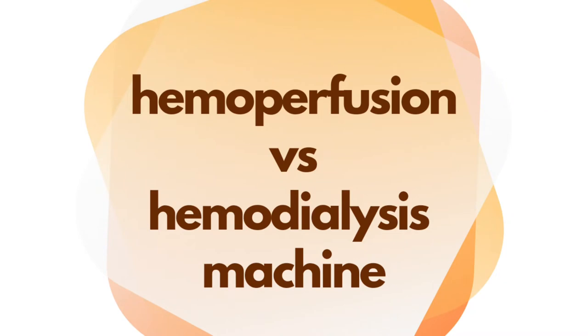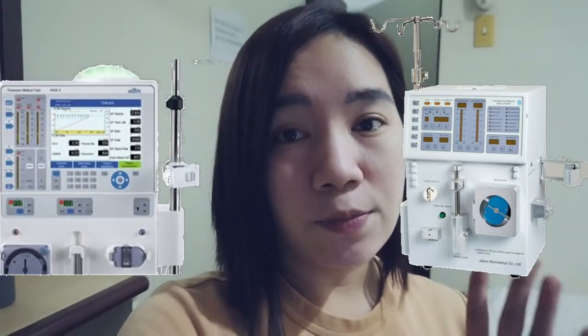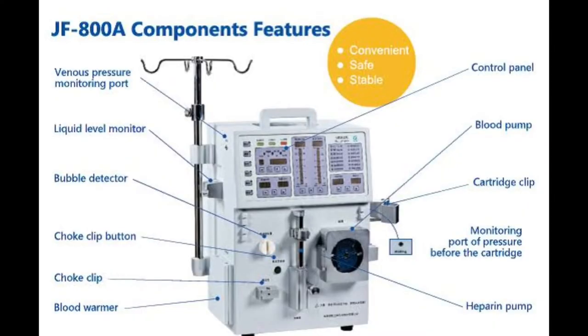Hemoperfusion versus hemodialysis machine — let's first compare how closely similar the two machines are and what differentiates them. This is the hemoperfusion machine; its look and features are more closely similar to that of a Fresenius dialysis machine, from transducer ports, liquid level monitors, bubble detector, choke clip, cartridge clip, heparin pump, blood pump, down to its control panel, which also consists of venous and arterial pressure monitoring, blood flow rate, hours of treatment, heparin interval rate, temperature, and different alarms.